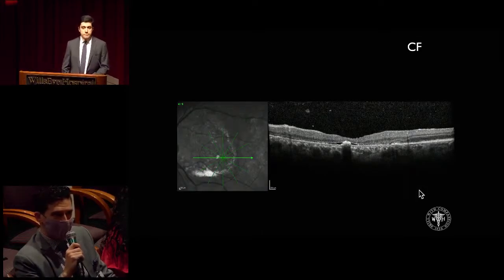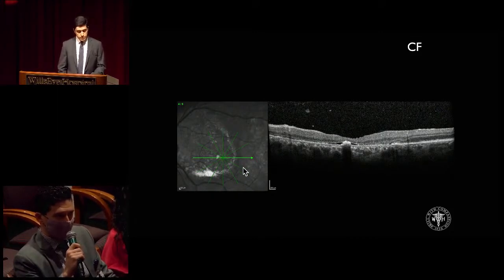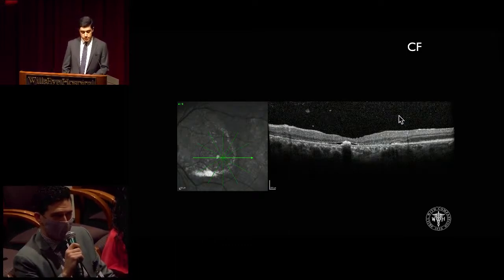In the left eye, again, the count fingers eye, this is again a horizontal raster scan through the fovea. First of all, in the en face imaging, you can see this well-circumscribed area of hyperreflectance on the IR corresponding to the borders of the retinal whitening we saw on the pseudocolor imaging. On the OCT scan itself, notable for some vitreous opacity here with these hyperreflective foci. The inner retinal border shows some irregularity, and there's some blunting of the foveal contour here. There is still an intact retinal nerve fiber layer. The inner retinal lamination patterns look intact, albeit a little bit distorted in their course here.